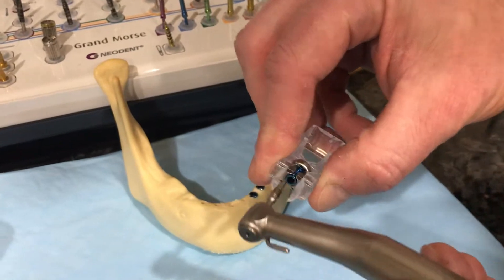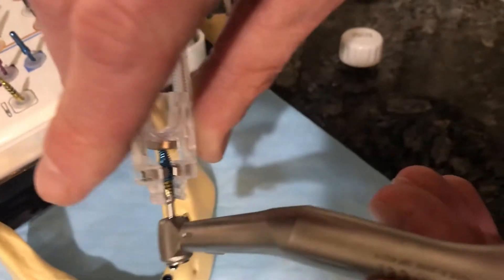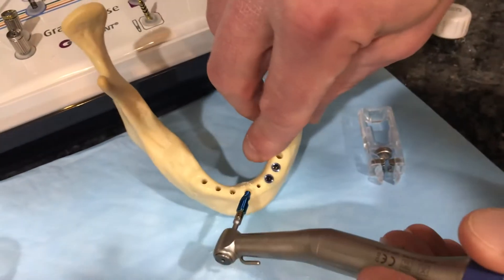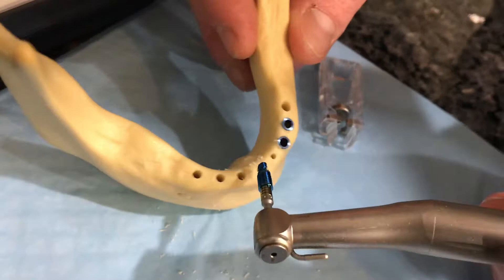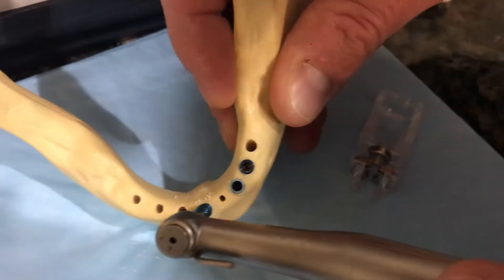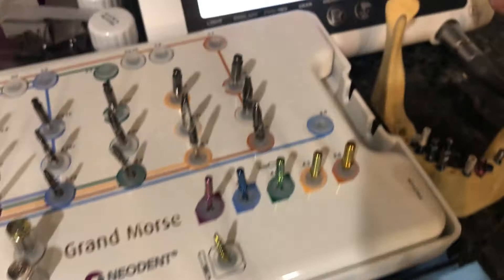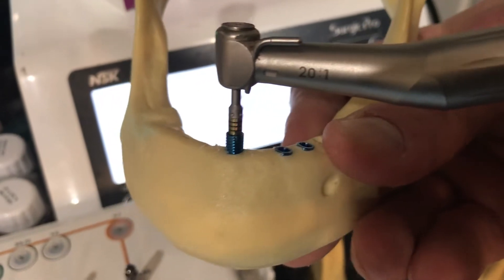I grab my implant with the squeeze triggers — my fingers are holding it so it's anti-rotational. I make sure the implant driver is down and flush, all the way seated. I step on the pedal and it spins very slowly. This is a 4.3 by 11.5mm implant and I'm simulating soft bone in the posterior maxilla. I step on the pedal and let the implant drive itself home. I got a nice bite — it torqued out at 35 Newton centimeters on the saw bone.